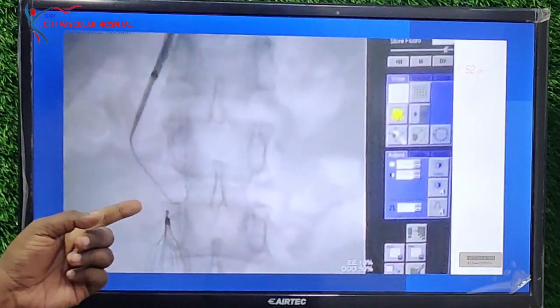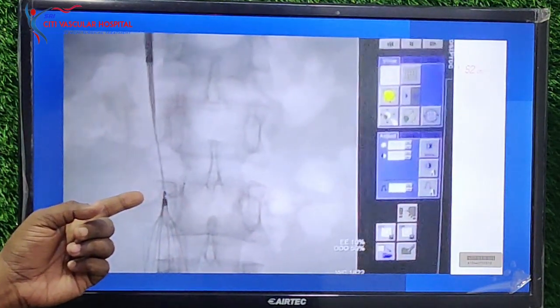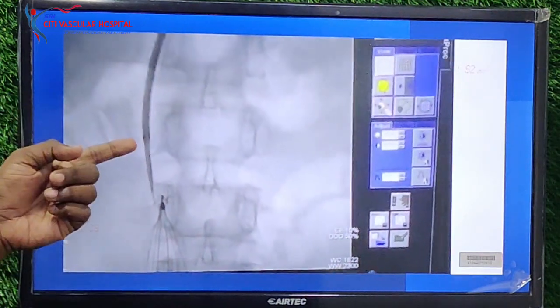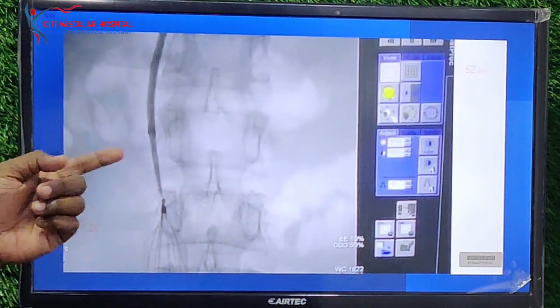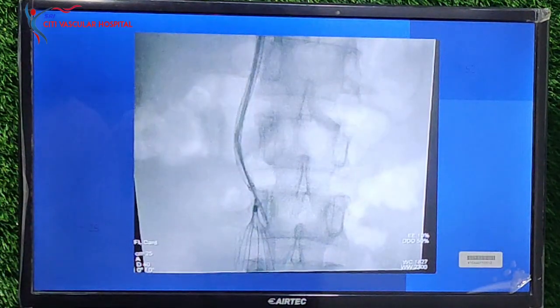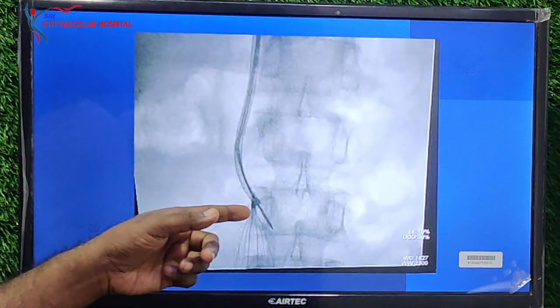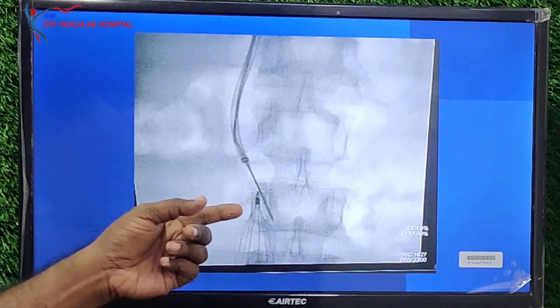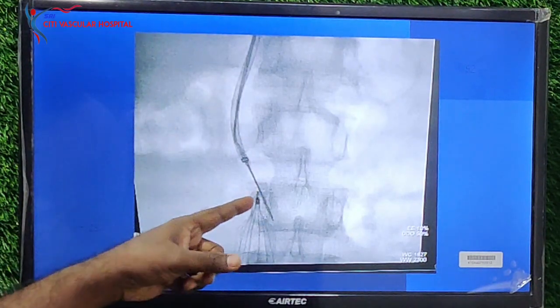We will try to reach as close as possible to the IVC filter, just above it. Through this sheath, we will remove the regular wire and the dilator, and through the 8 French sheath we will place the snare. Once we are in position, we will try to snare it and capture the hook of the IVC filter.